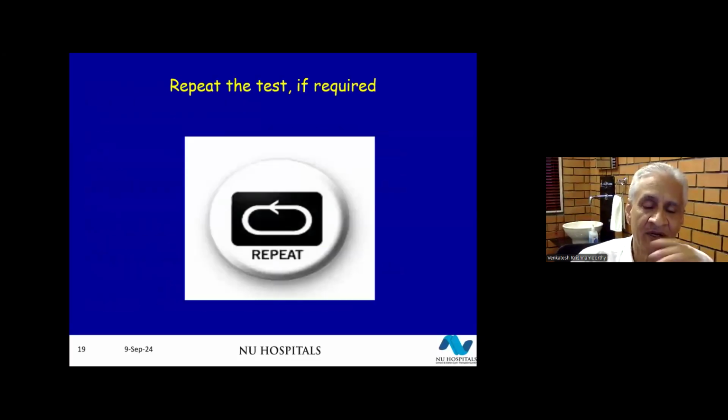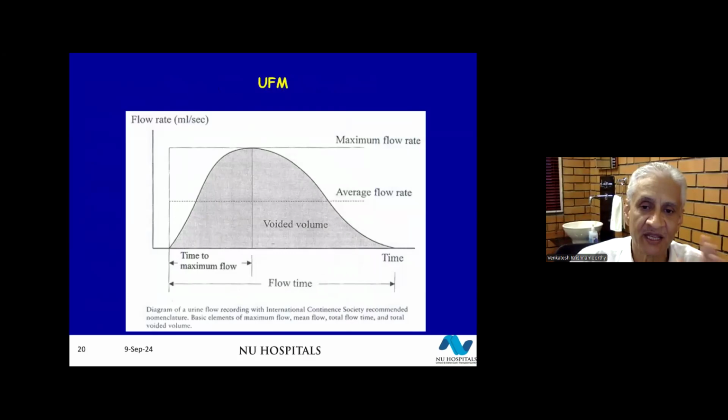Finally, if you are not satisfied, if the patient says, look, this is not how I pass urine at home, repeat the test. Don't hesitate.